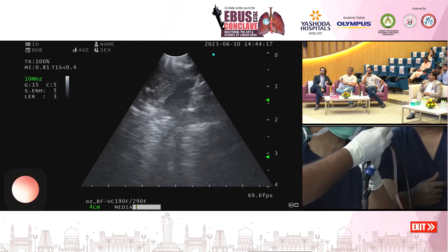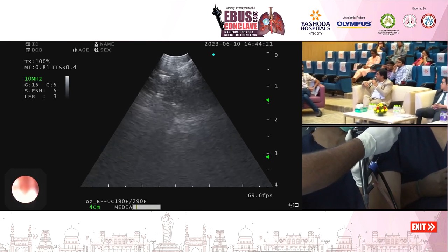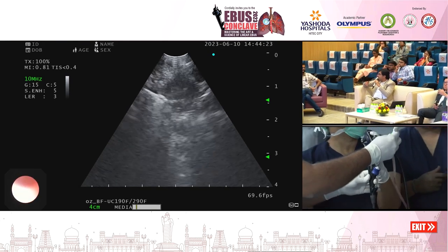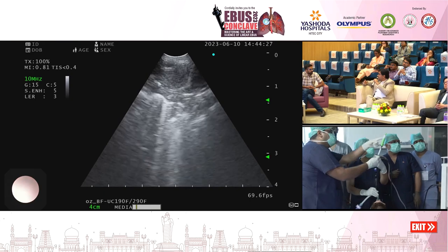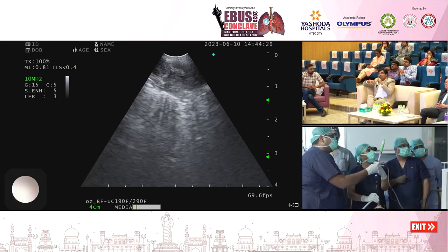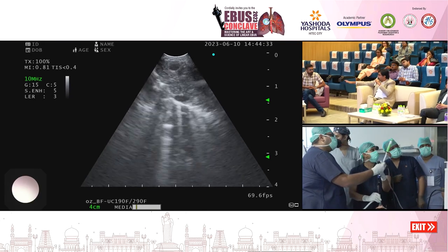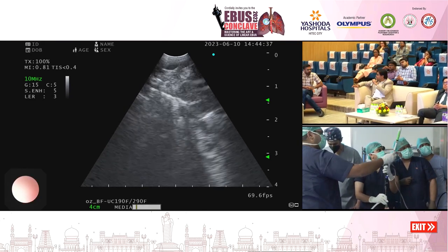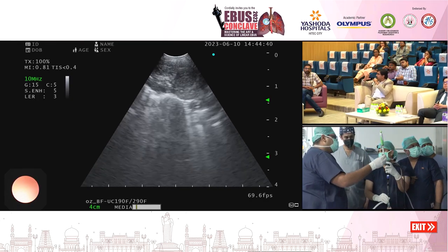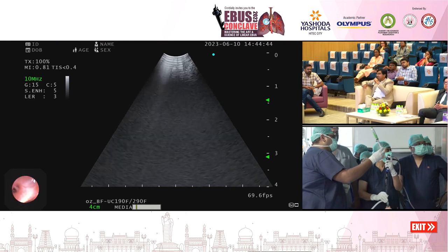While they are doing this, the next practically relevant thing in this case is to differentiate TB from sarcoid. Now that the rapid on-site evaluation has already confirmed the presence of granulomas, the next thing for us is to get material for microbiology. The tuberculin skin test definitely has a role, because in a patient with a granulomatous node, if you get a strongly positive Mantoux, then you rule out sarcoid. So that is the role of TST.